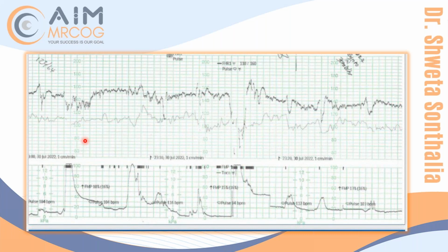So at least you can take advantage of that and make your life simple, because I even used to get shivering when I saw CTG at that time. But now no more. So always, as I told you, 88% or more are variable. So try to fit into that unless you are not able to.